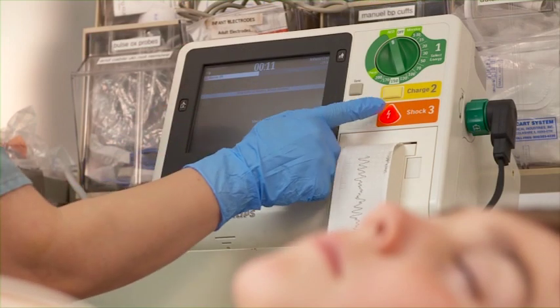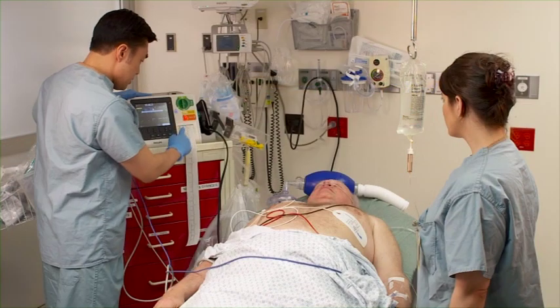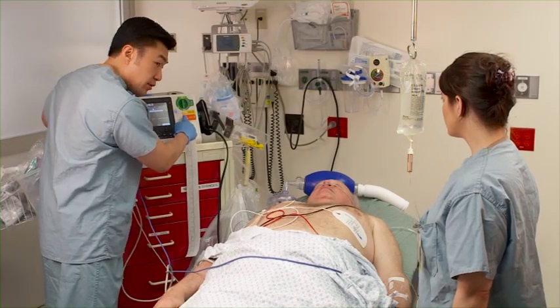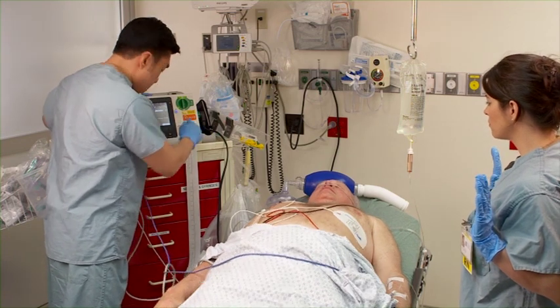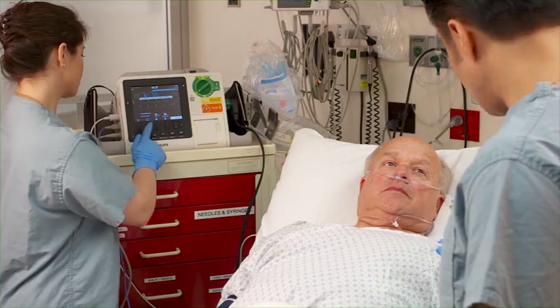With monitoring setup complete, we can now turn our attention to the therapeutic use of the device. The HeartStart XL Plus provides therapy options including semi-automatic and manual defibrillation, synchronized cardioversion, and pacing.